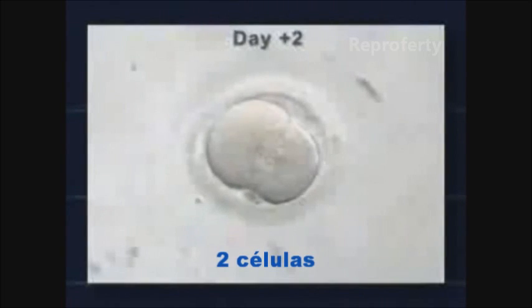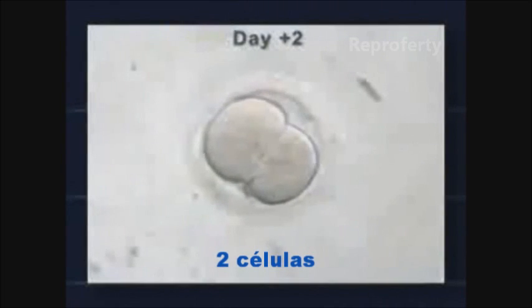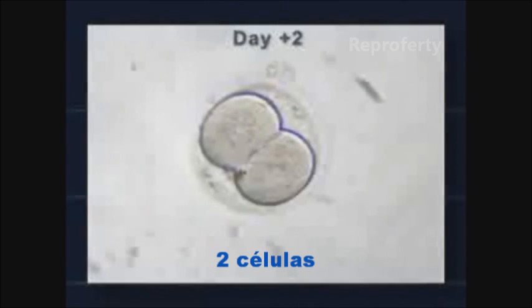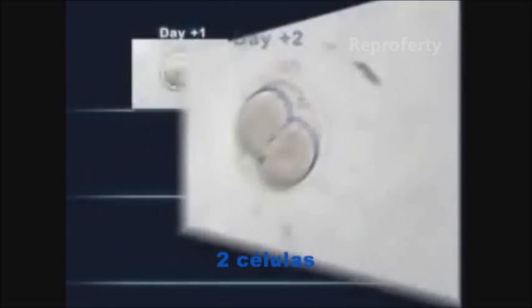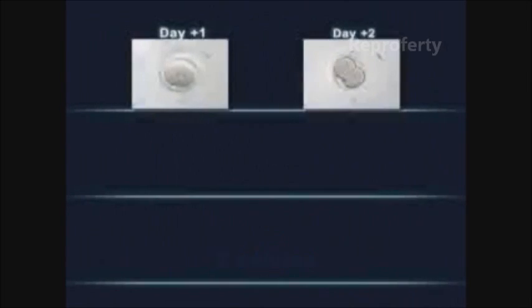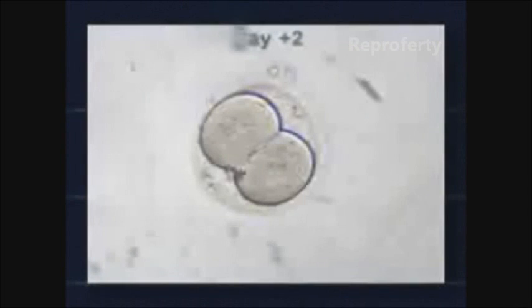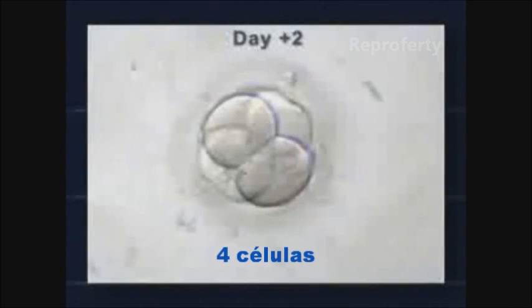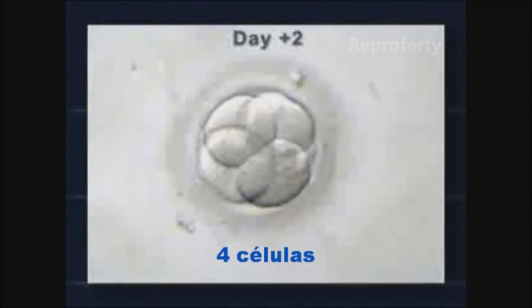Two days after puncture, the embryo divides itself and contains two cells with one nucleus per cell, which in turn starts to divide into an embryo of four cells if its development is optimal.